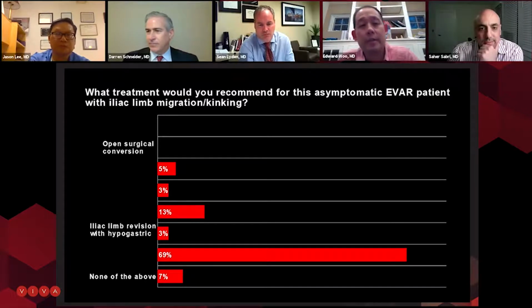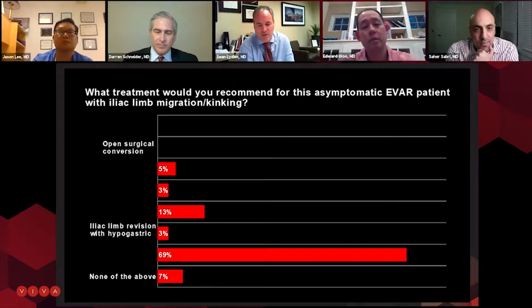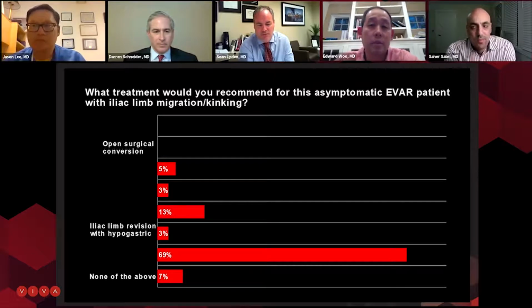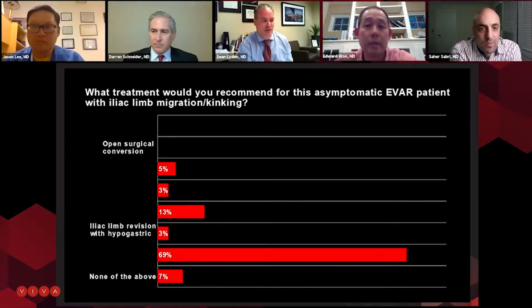There's a fair amount of data now suggesting that with the proximal aortic neck, if we're going into something greater than 30 or 32, there's going to be aortic neck dilatation over time. And so there's really no good reason to land a 28 device in an iliac artery. I mean, do something, right? You can do an extra-anatomic bypass, or you can debranch it. You can do the branch device. You can do a parallel graft. There's so many options that it just doesn't make sense to put a 28 in an iliac.